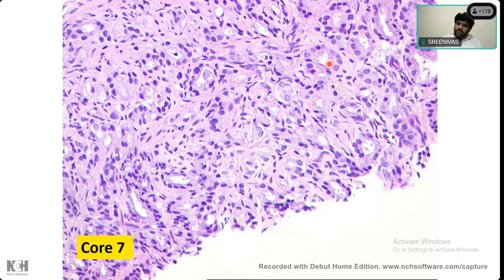And how is their lumen? Rigid, small glands. Rigid and small, little secretions. So you agree that this is cancer? Yes, sir. This would be cancer.